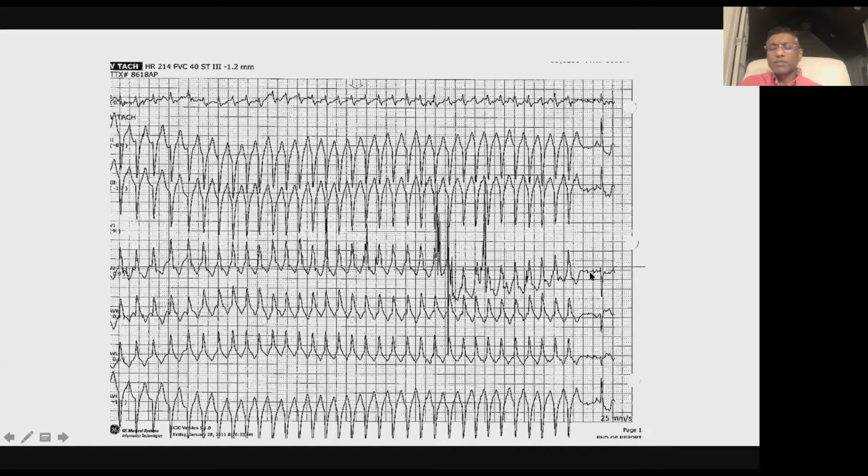And you will encounter the exact same problems when you look at tele strips in your ICU or in your ER when they come in. If you print them, they'll have all kinds of noise on them. You've got to figure out what's P wave, what's not. Now, when you look here, what I can tell is after it breaks, there's at least one skinny looking beat here. You agree? Yes, sir. Okay, so it looks like maybe a normal QRS over here.